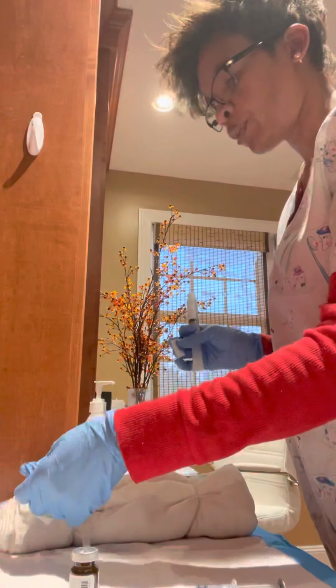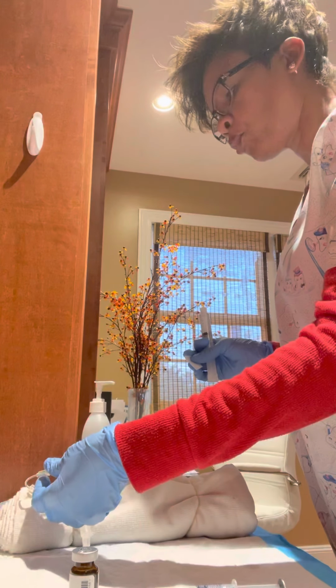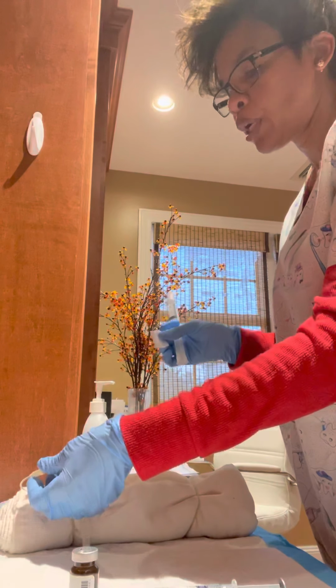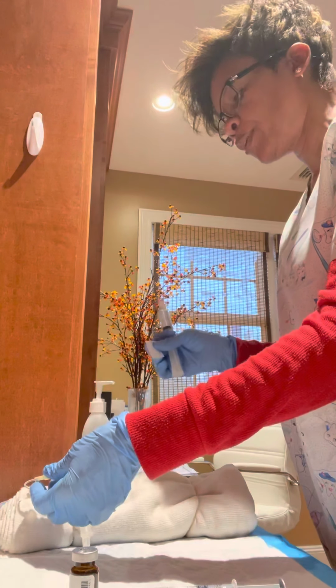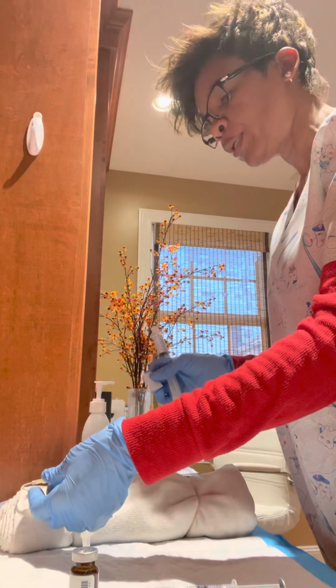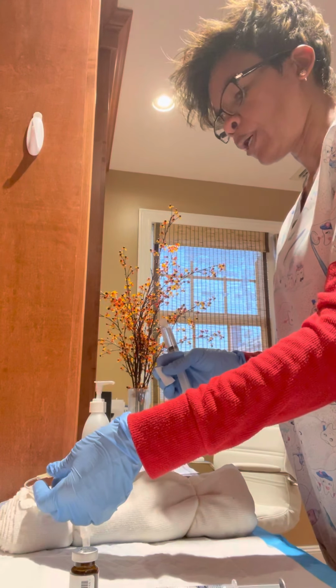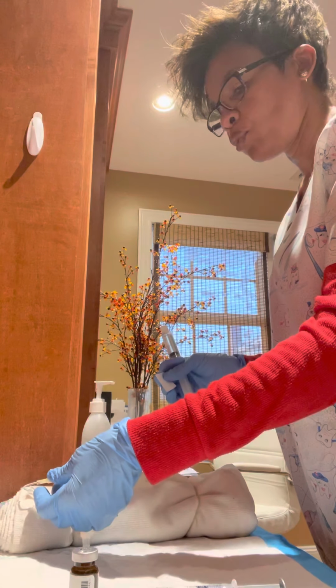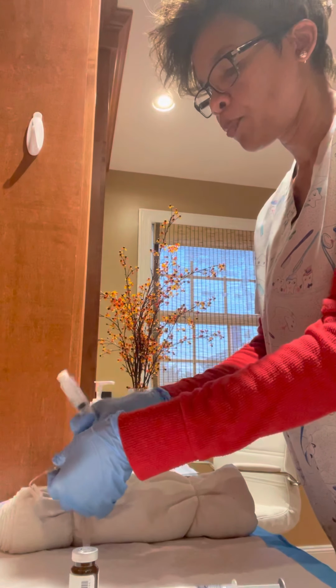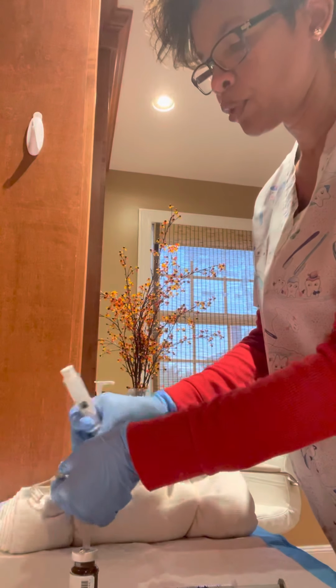And then what I'm going to do is clean the port. And while I'm cleaning the port, I'm just going to assess the site, which is very important. I looked at it before, but I'm also looking at it again. There's no redness, there's no swelling, so there's no indication of any abnormality, no infiltration or phlebitis. And then I'm going to just clean the port real good.